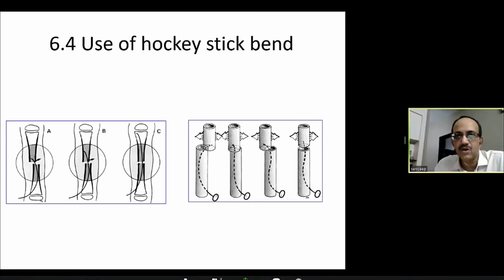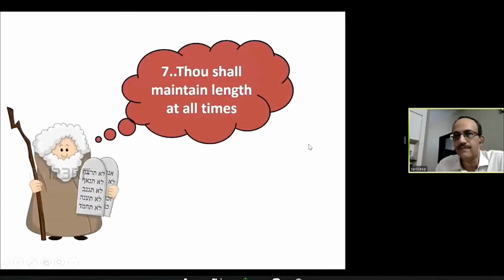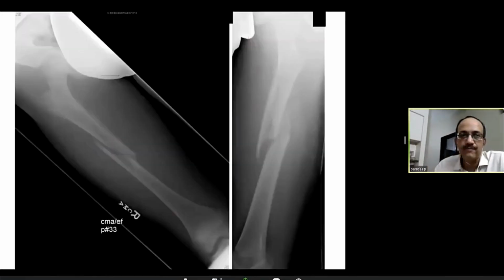Use a K-wire, use the hockey stick bend, use the F tool and get your reduction. Get one nail across first before you pass the second nail. The seventh commandment is that thou shalt maintain the length of the femur at all times, which is why we said that comminuted fractures are not such a good idea.